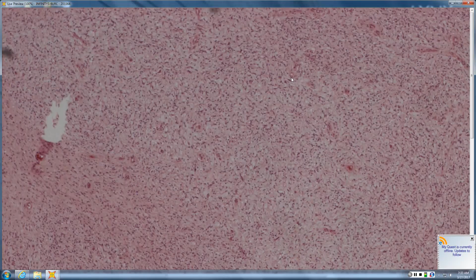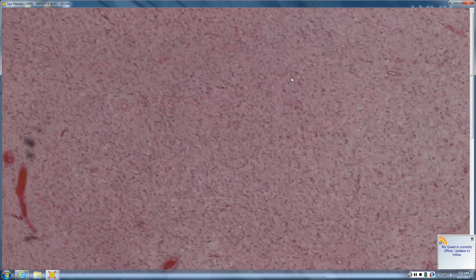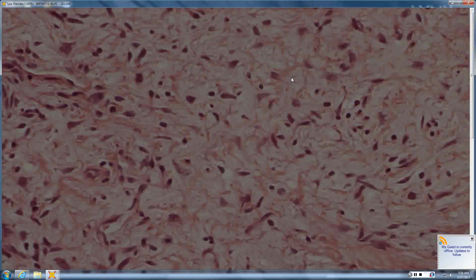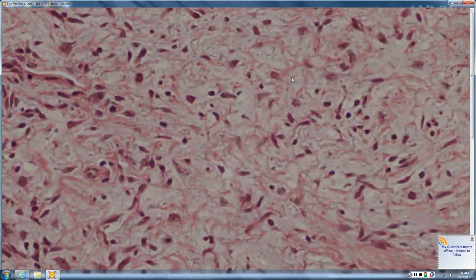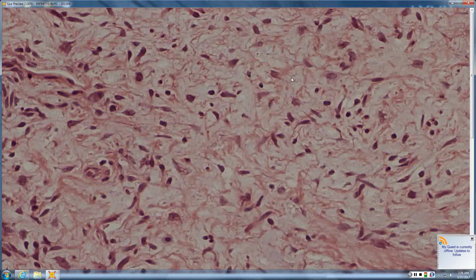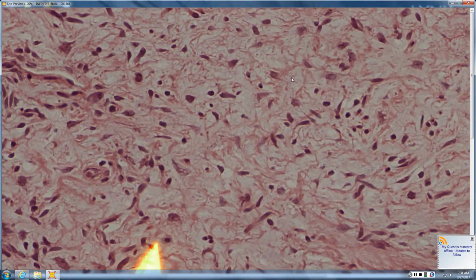You may have some preserved nerves within it, but the majority of it is loose myxoid proliferation that has all supporting elements of the nerve, to include Schwann cells, which tend to be curvy and S-shaped, mast cells, which look like little fried eggs. So you're absolutely correct.